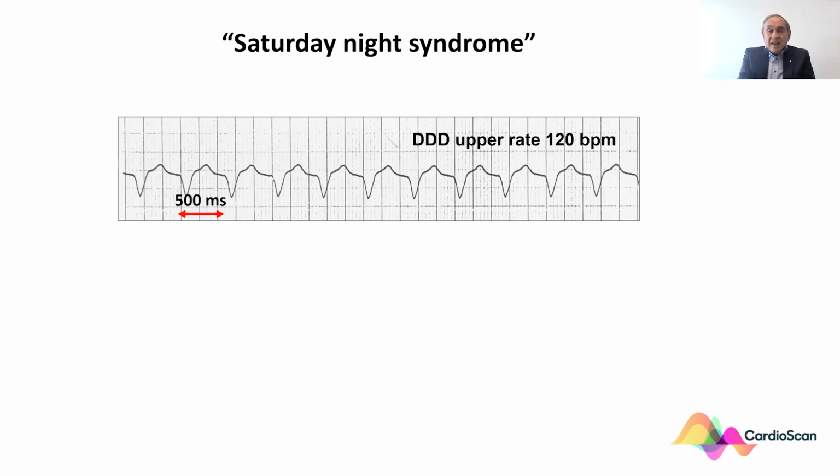One of these types of rapid pacing is what I call the Saturday night syndrome. This used to occur quite frequently with me on a Saturday night when I was out visiting, and I would be called into the hospital because the patient was in the ER with a rapid ventricular pacing, such as here, DDD upper rate 120.